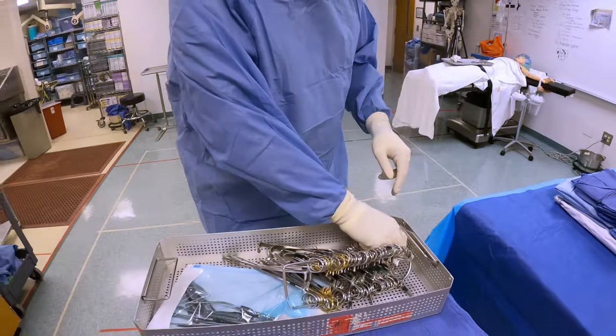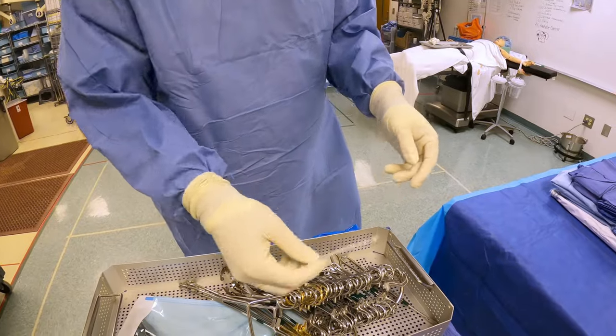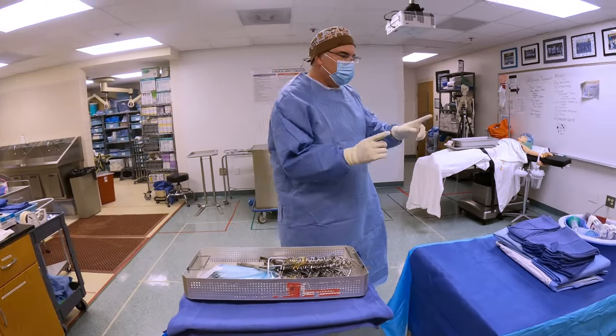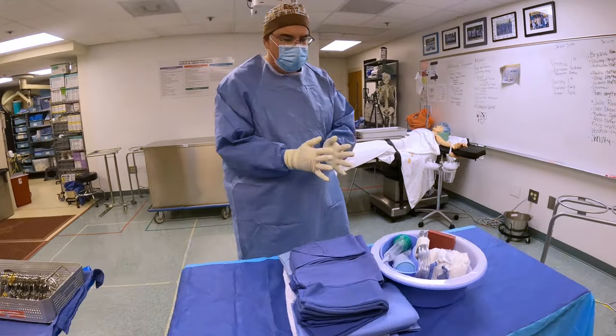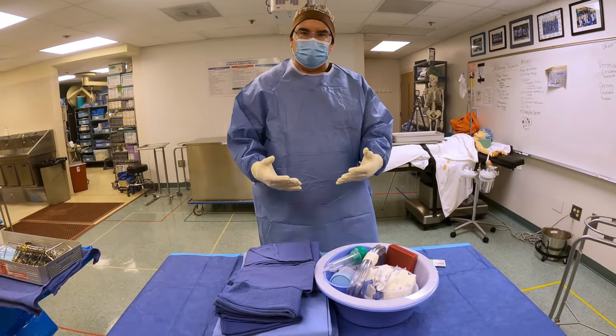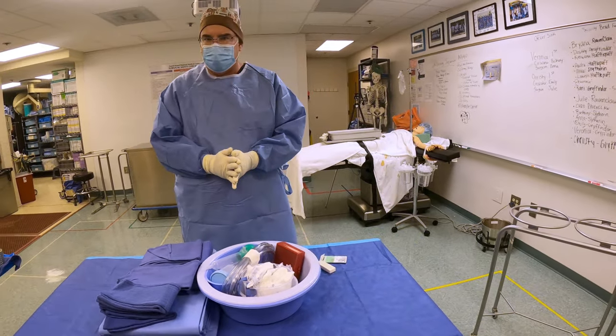This way, if this turns out to not be sterile, or we can't tell if it's sterile, I haven't contaminated any of my back table. The only thing I've contaminated is my outer pair of gloves and the mayo stand, which is very easy to re-drape and re-towel off. So I'm going to look through here — sure enough, there's my indicator. It's okay, it's all good. My instruments are okay, which means it's time to bring them back over to our back table.